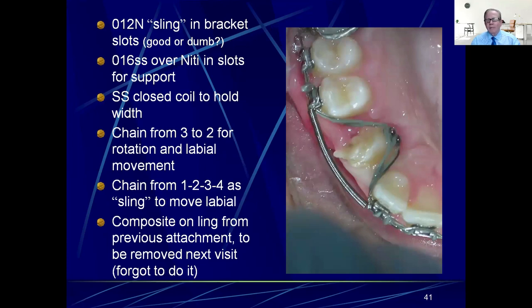I asked myself: is that good or is that dumb? Later I found out it was really dumb, because I had it tied in so tightly underneath the main 16 steel wire that there was no flexibility — it was stuck right in the slot and did absolutely nothing. If you're going to use something like that, you have to allow it to slide in the slots. A simple NiTi in the brackets and then tied behind there, with open stainless steel coil to hold the spot, probably would have been a better idea.